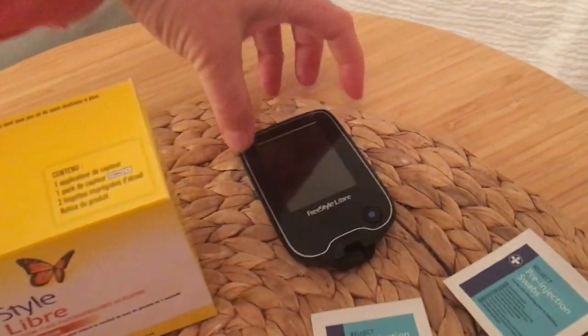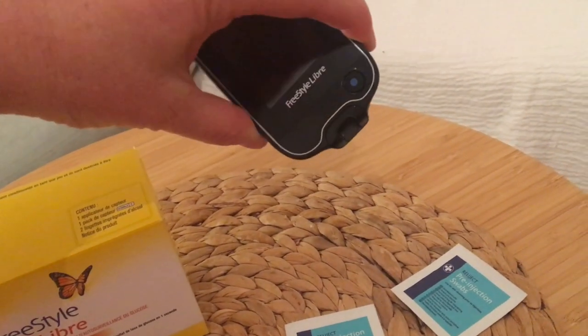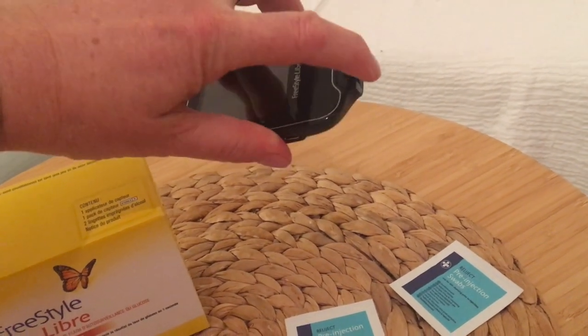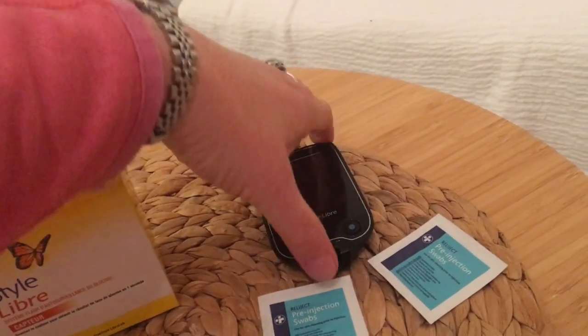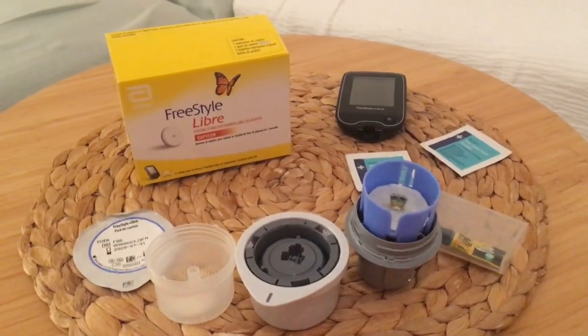And this is the reader — it also doubles as a glucose meter, you can buy strips. And you can also use your smartphone to scan the sensor if you have a modern smartphone.